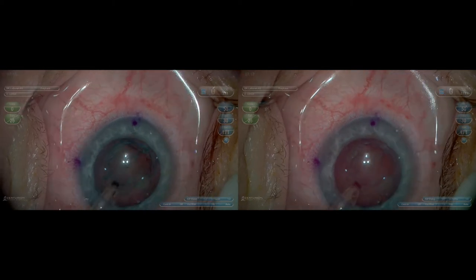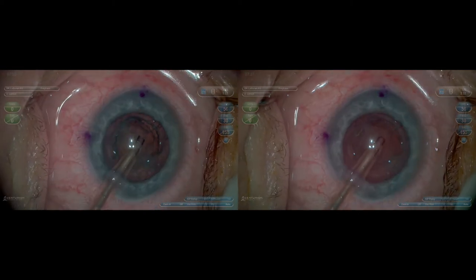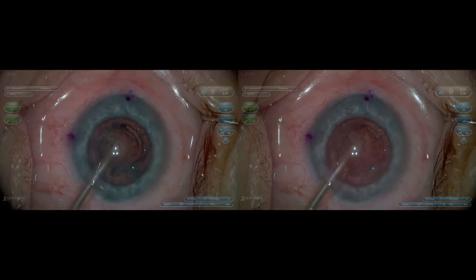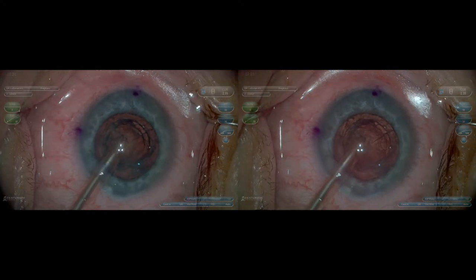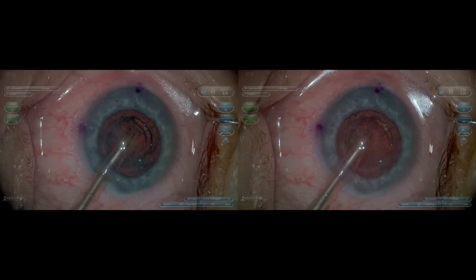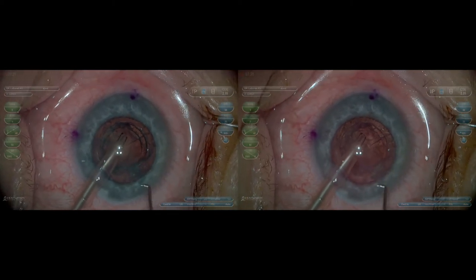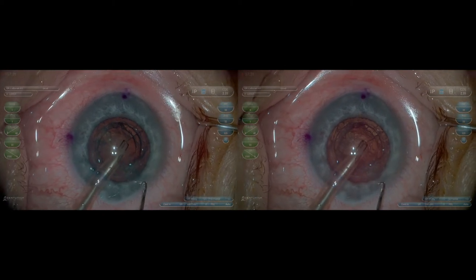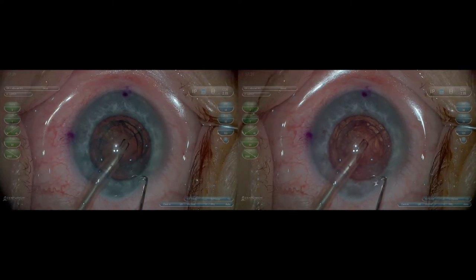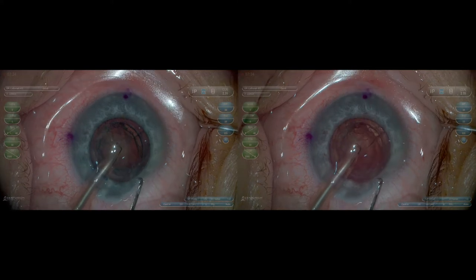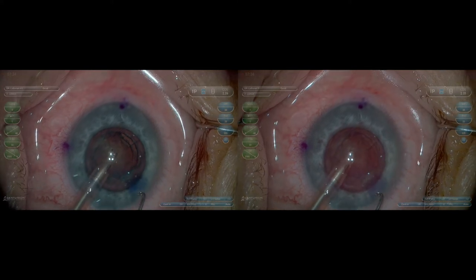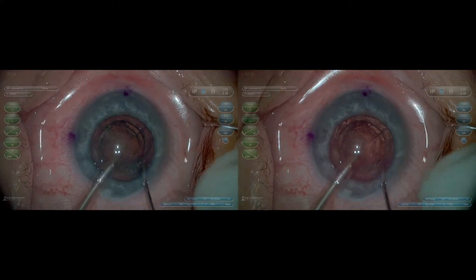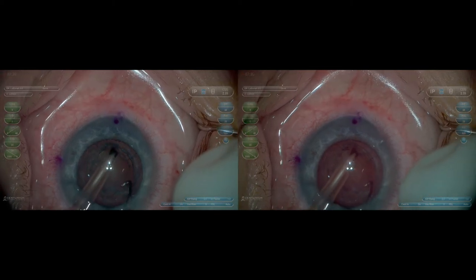In this case, too much light would actually make it more difficult and wash out the image. So the system is optimizing the image. You can see how nicely I can see centrally as I'm removing and working in the nuclear area, while I can also see the cornea and the white square underneath as well.